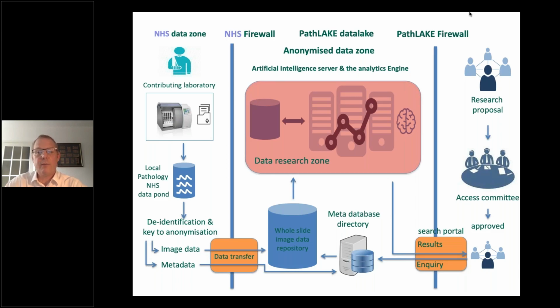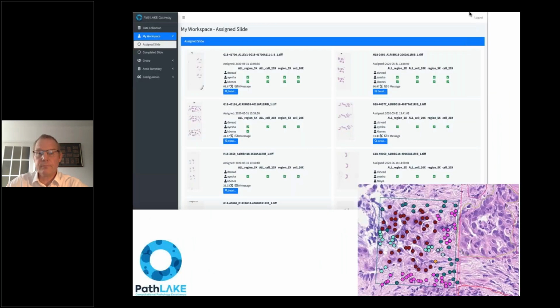And by doing so, we are able to make available vast amounts of whole slide image data for research, which would otherwise not really be feasible or possible. So this is an overview of how the data lake looks when you get in there. This is one of our own projects, of course, so we've got pathologists listed on the talk at the end here that were taking part in this project, looking at slides which are visible on the viewer, and can make annotations to those slides as shown in the bottom right hand corner for the research that's required. So this is just one example of how the data lake would look to pathologists coming in to use it.